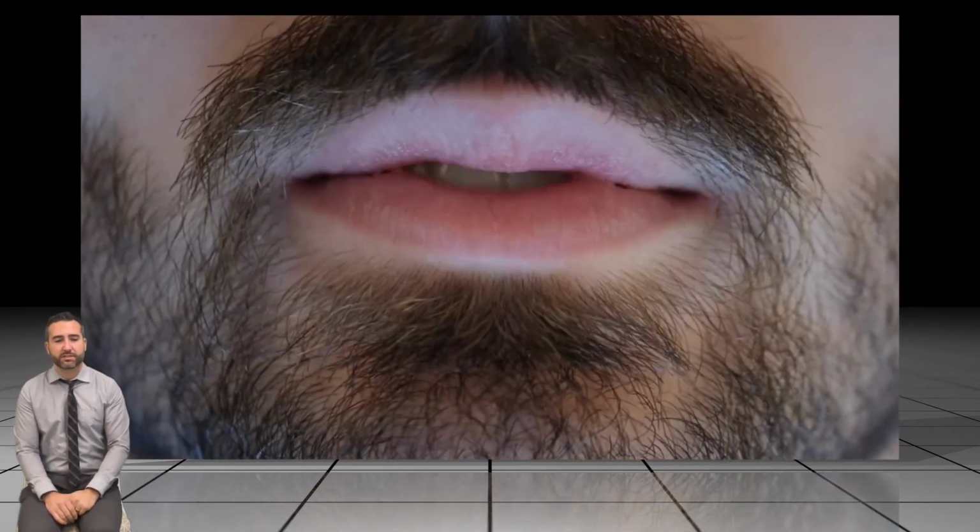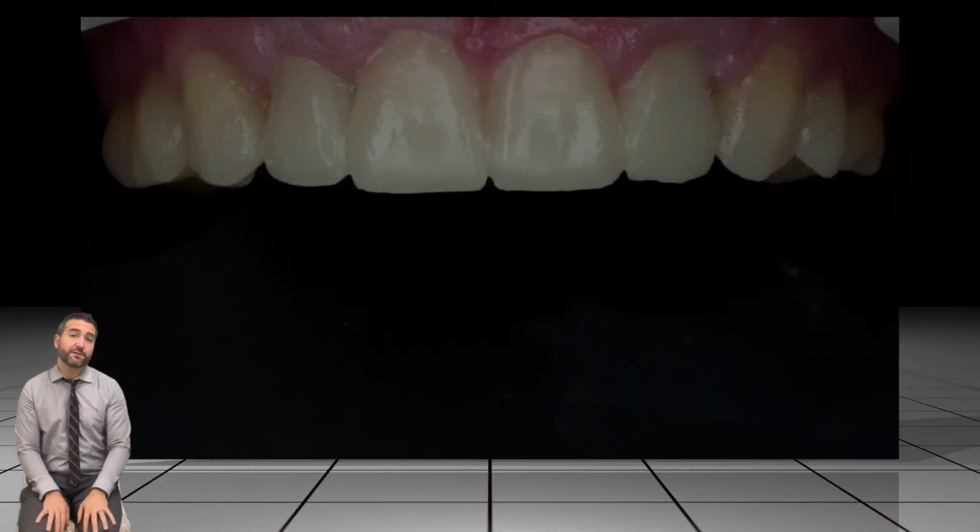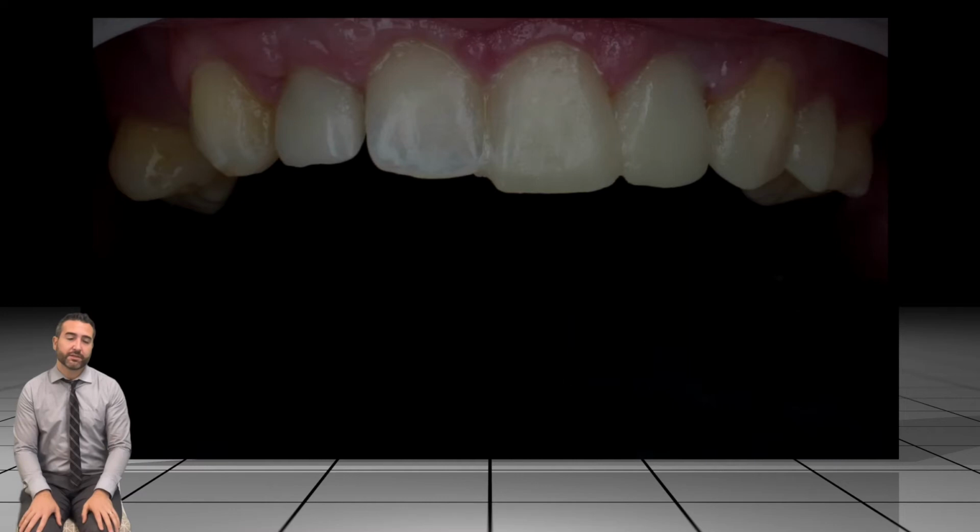All you have to do is 3D print it and transfer it to the patient's mouth like this, and you could see how excited this patient is. I often video them speaking and going through some phonetics, looking at incisal edge length, making sure midline's on, making sure everything's okay. And then what I also love to do is break this off in half, kind of a hemi arch. So I'm going to take off one side and then let the patient look in the mirror, because you'd be surprised how fast they forget what is underneath them. And so then the patient's usually shocked and they're even more ready to go through the treatment. I can't tell you how much of a game changer this alone has been.